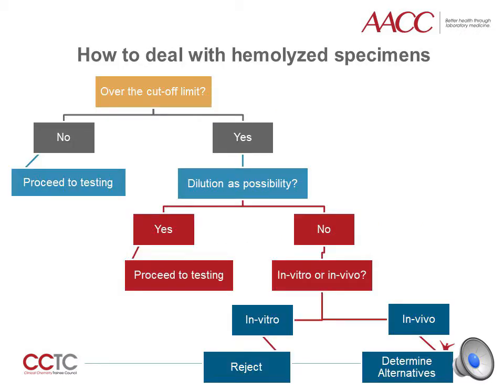The way to correct hemolysis largely depends on the analyte and the instruments in your laboratory. One way to deal with hemolyzed specimens is to first determine if the H-index is above the hemolysis cutoff limit for the analyte of interest. If the H-index is below the cutoff, you may proceed with testing. However, if the H-index is above the cutoff limit, determine whether you are able to dilute the sample by referring to the manufacturer guidelines. If dilution is not acceptable, determine whether it is in vitro or in vivo hemolysis. This can be accomplished by measuring haptoglobin. Decreased concentrations of haptoglobin are pronounced and a specific effect in in vivo hemolysis, whereas haptoglobin levels remain unchanged in the in vitro hemolysis setting.